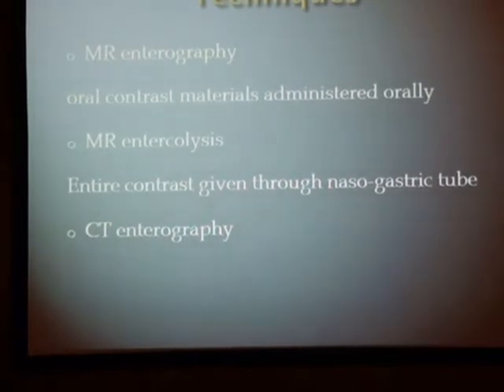There are three techniques that we can do now: MR enterography, where oral contrast media is administered orally; MR enterocolysis, which is less convenient to the patients because it's given through a nasogastric tube, so it's limited to certain indications; and CT enterography.